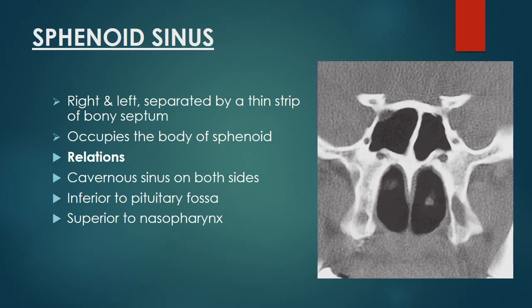Coming on to the sphenoid sinus: there are two sphenoid sinuses, right and left, separated by a thin bony septum, present in the body of the sphenoid bone. The coronal CT image shows bilateral sphenoid sinuses with a bony septum in between. Relations of the sphenoid sinus include: inferiorly the nasal fossa or nasopharynx, superiorly the pituitary fossa, and on both sides the cavernous sinuses. Also visible are the anterior clinoid process, foramen rotundum, and vidian canal.